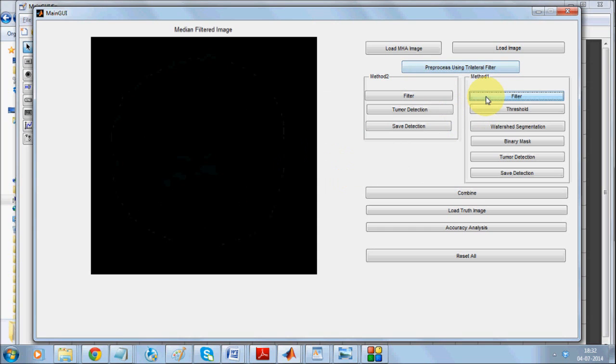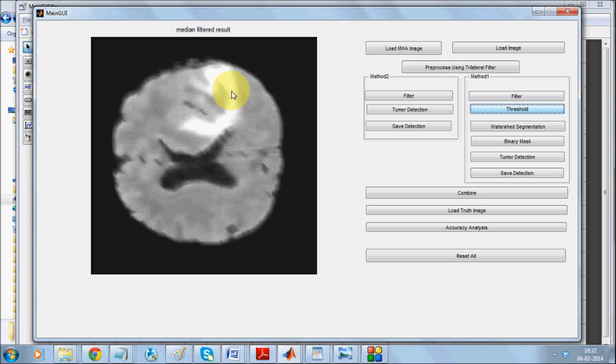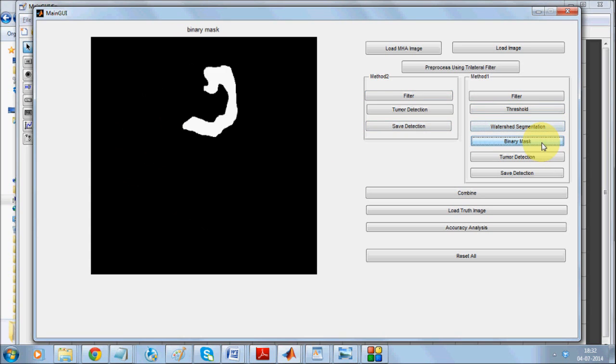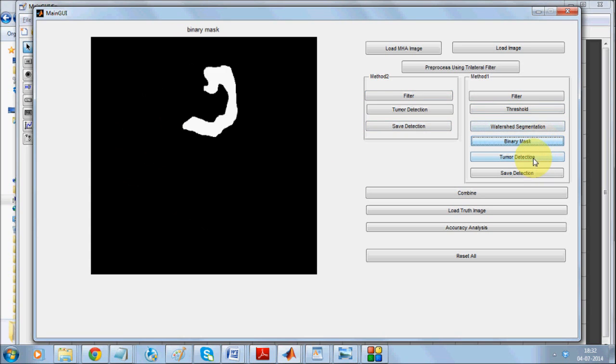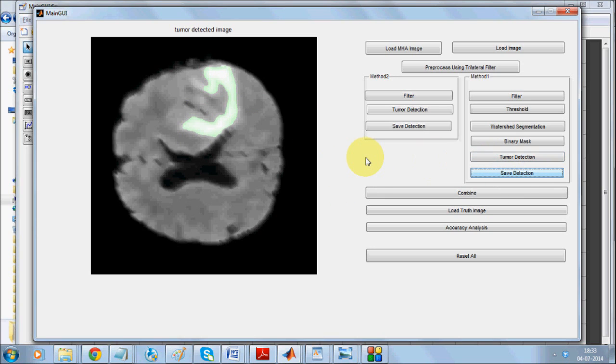Now I'll be applying the median filter and thresholding. Once it does the median filter it will suppress the rest of the boundaries and make this more prominent. We go for watershed segmentation that segments the whole brain into smaller watersheds, apply a binary mask, extract it, and detect the tumor.